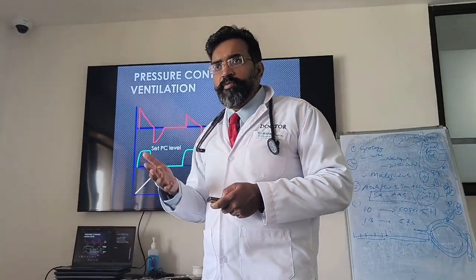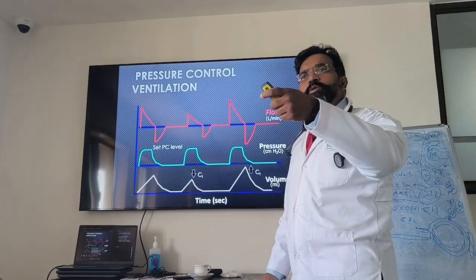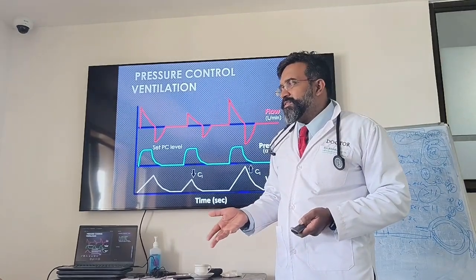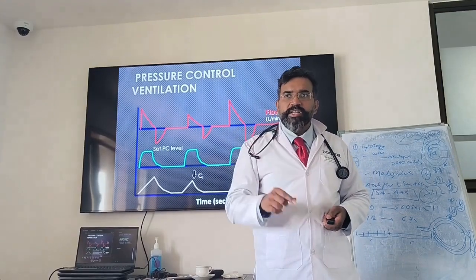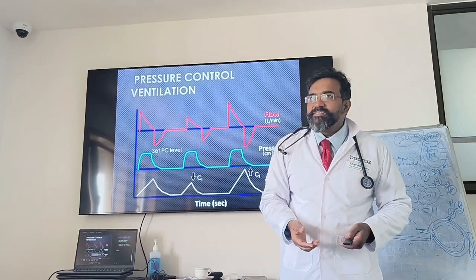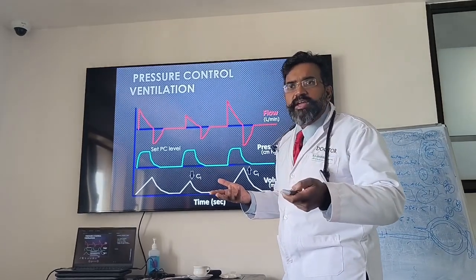Volume. Because the volume is going to vary. So on a pressure control mode, what do I need to see? My volumes. I need to see my volumes. So if in a volume control mode, seeing my volume isn't making sense. If in my volume control mode, if I'm going to put volume in my monitoring chart, what is the point? In my monitoring of the ventilator, मेरे को एक नजर से पता होना चाहिए ना क्या हो रहा है when I'm walking about. ठीक है? If I put a volume, then what is the point? I've set 400. क्या फर्क पड़ने वाला? Are you understanding?